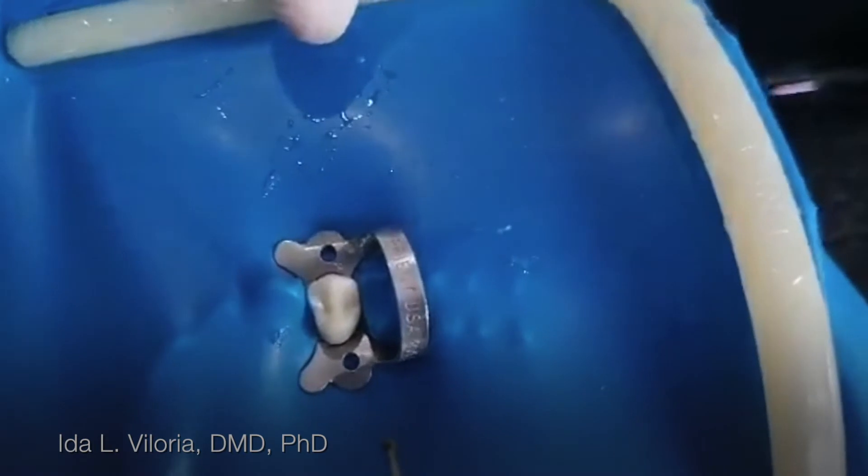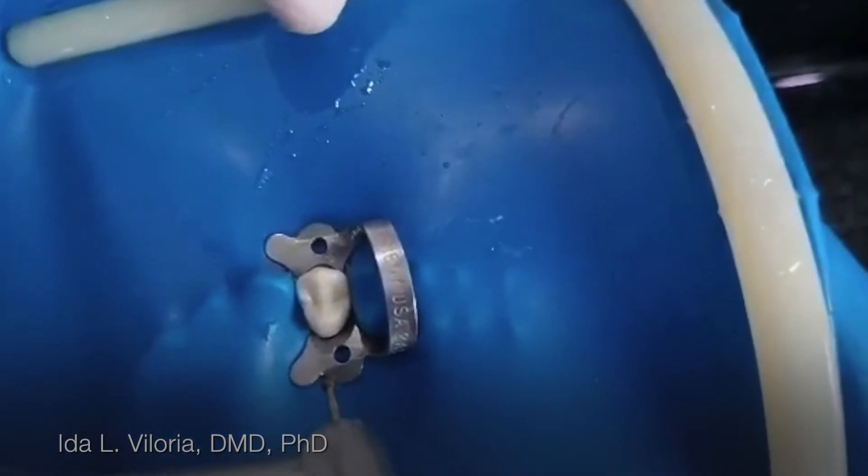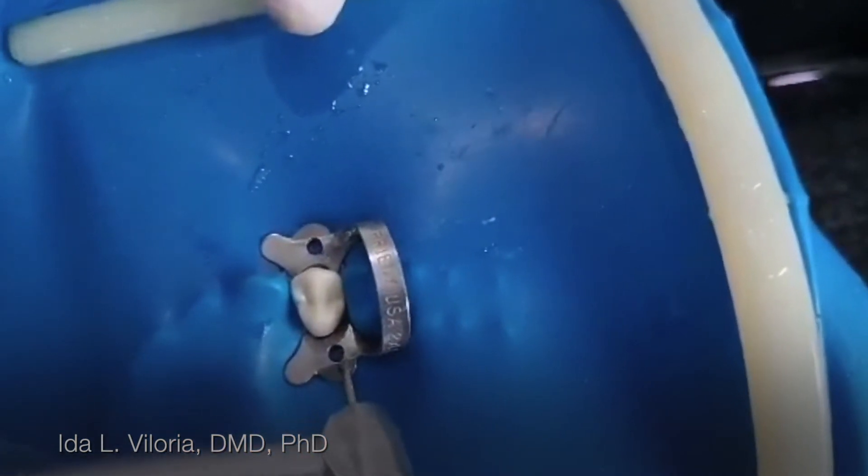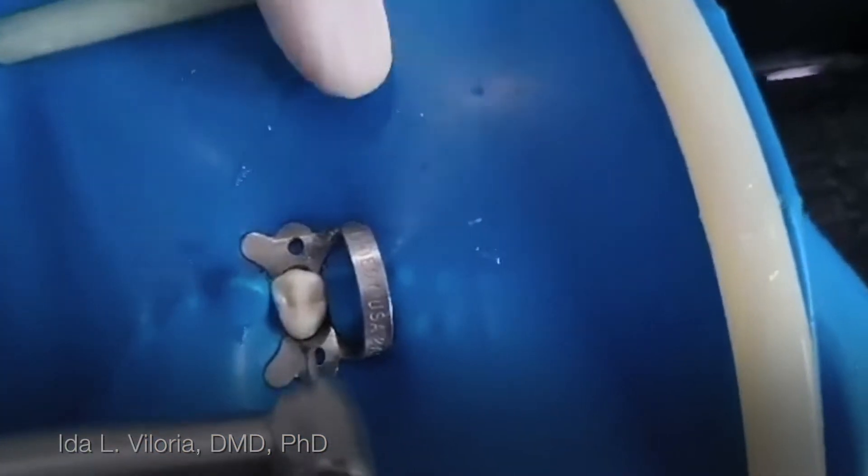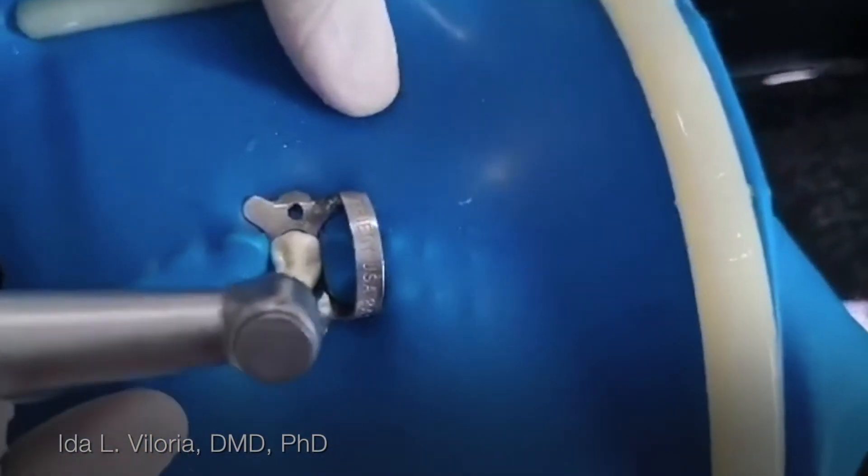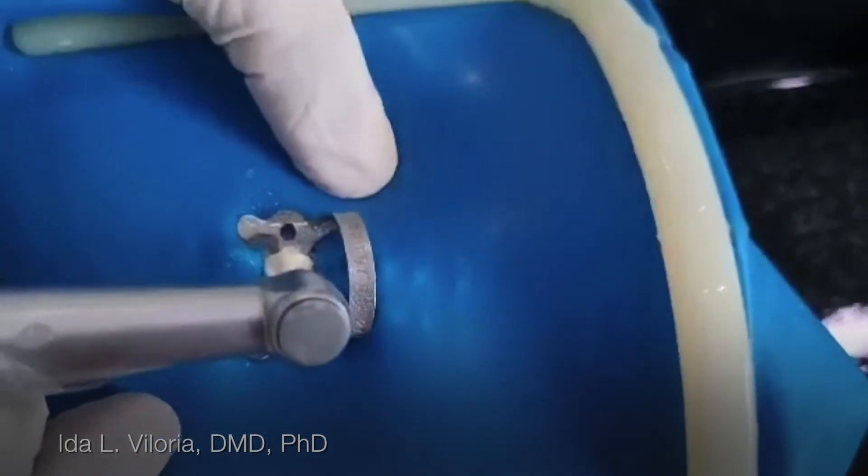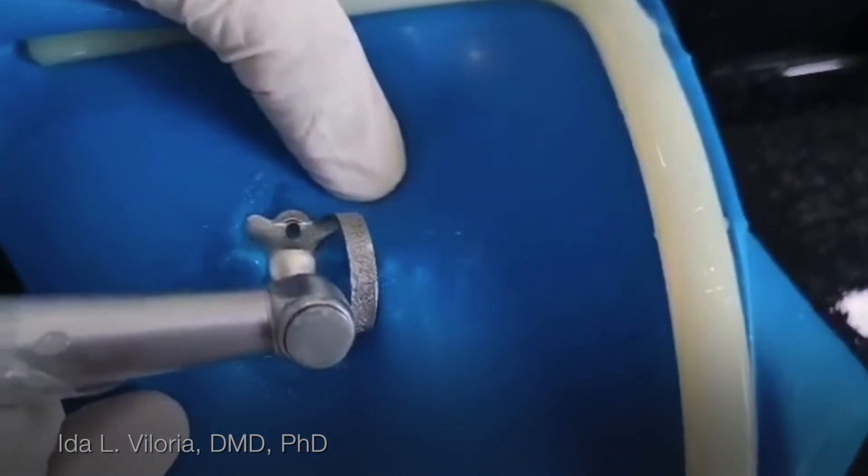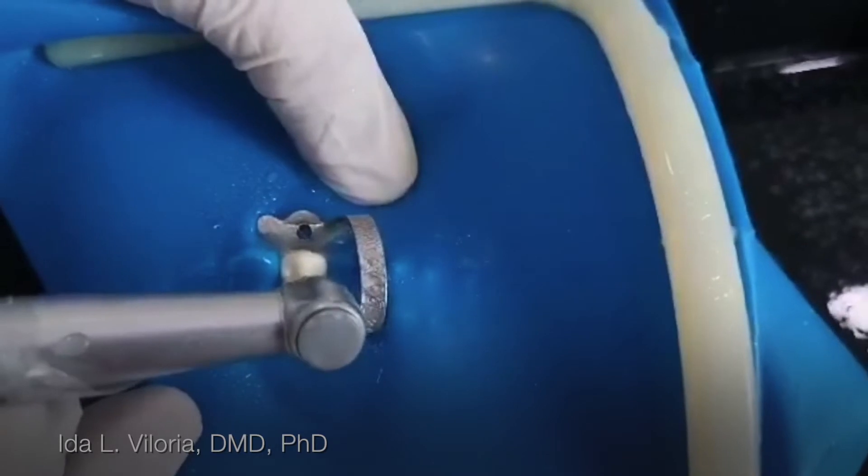I'm going to do access cavity preparation of maxillary first premolar using this typodont. I'll just have to start at the center. Start at the center using number two or number four roundburn.